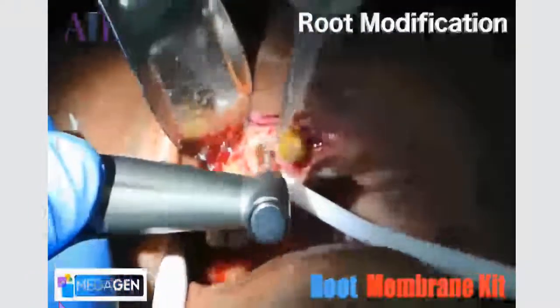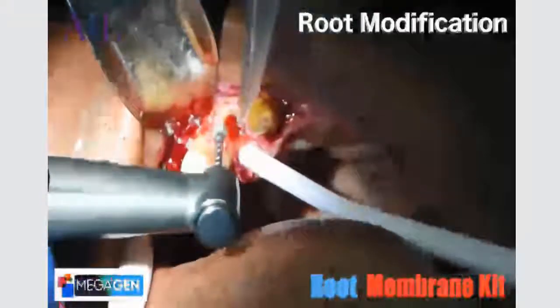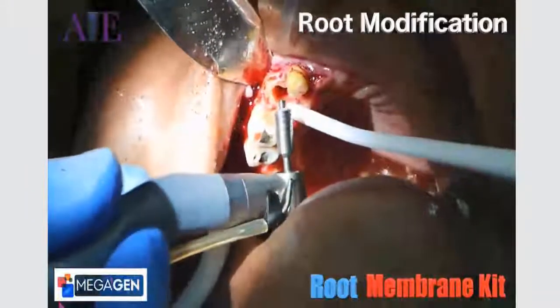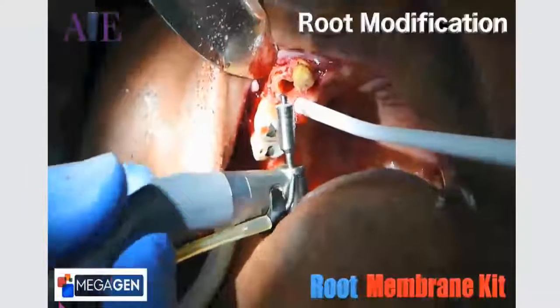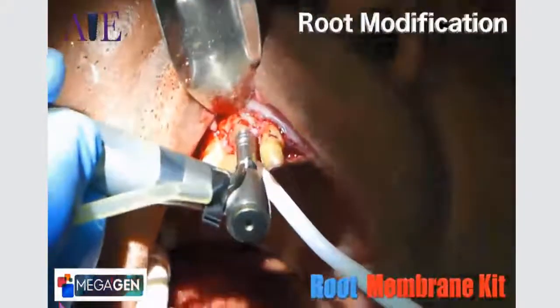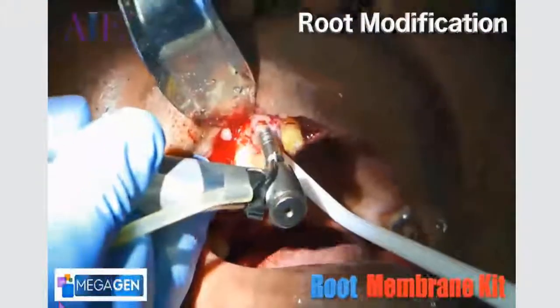and basically sculpt the inside of this root to be able to maintain the very fragile buccal plate of bone while also leaving enough room to place the implant in the palatal aspect.